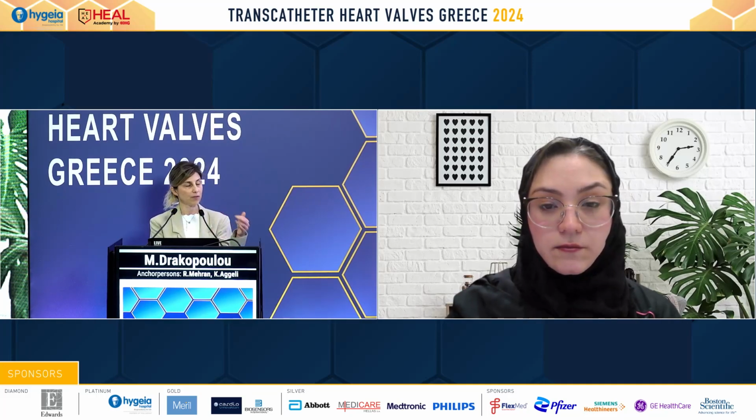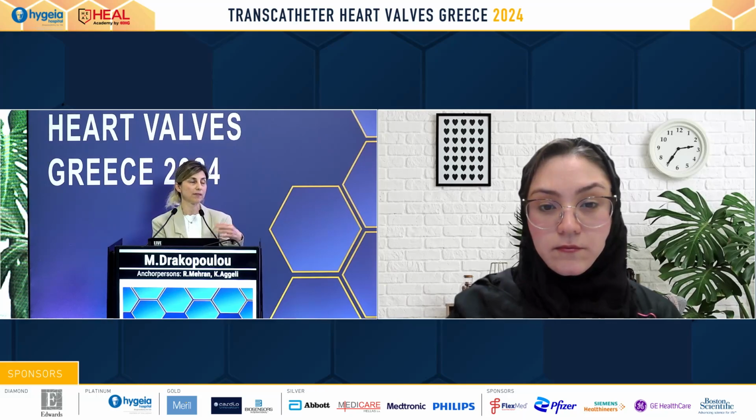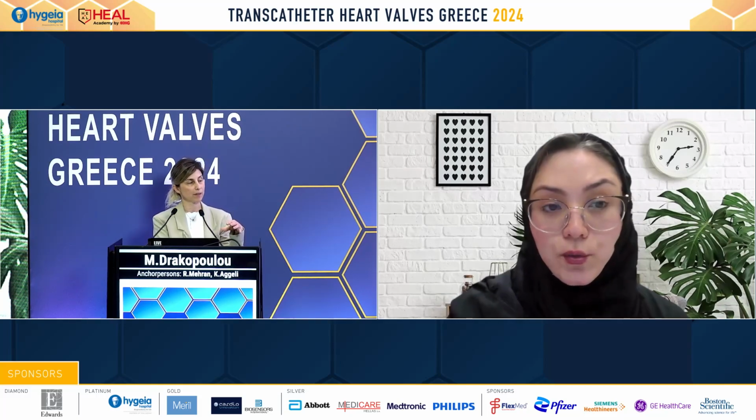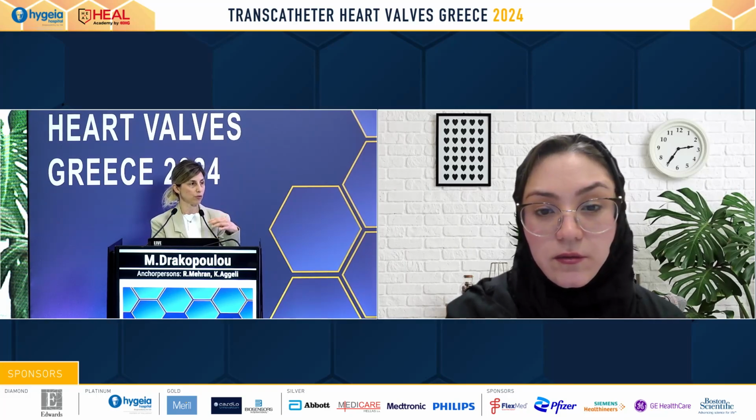I don't believe that in everyday clinical practice we need more imaging, but in patients who are scheduled or are up for discussion for further interventional therapy or even surgery, maybe we need something more, but this is individualized. Maybe we need cardiac CT or even MRI, in congenital patients for sure. But overall, I think that in everyday clinical practice, transthoracic and transesophageal echo is good, except for individualization when we have to discuss intervention or surgery.